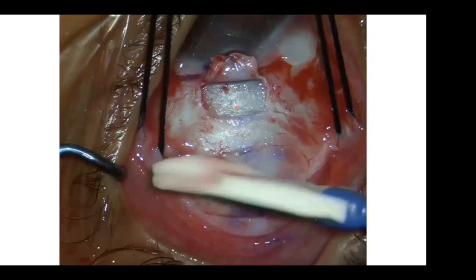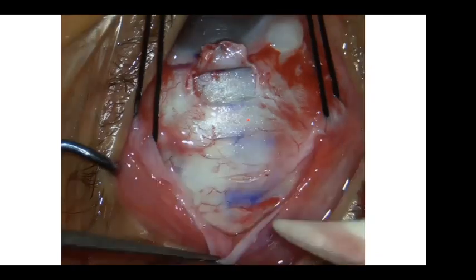Definitely I'm just presenting what I'm doing, and I know there are hundreds of modifications. I have experts with me, Dr. Ali, Dr. Hassan, Dr. Mazen, and lots of glaucoma surgeons. They have their own tricks, but I'm just showing what I'm doing in reality. And then the scleral flap, it's better to be a thick flap. It's different from the deep sclerectomy, which is a thin flap. I like to go for a thick scleral flap.